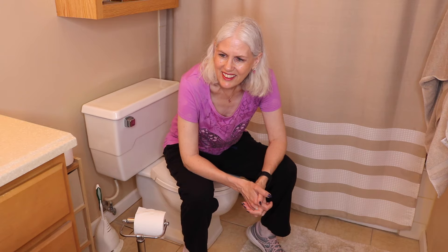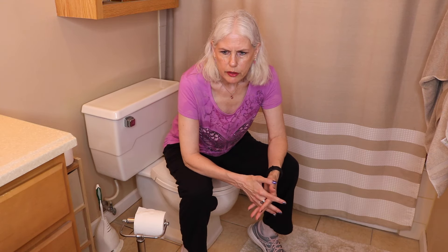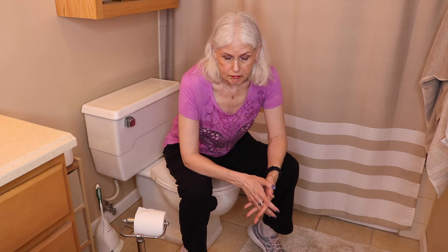Hi, Jenny here coming to you from my bathroom. It's a bigger bathroom — I thought I'd have enough room for the camera, but if I sit up I kind of cut off. In any case, I'm here in my bathroom because I thought I would make a short video about how to empty my colostomy bag.